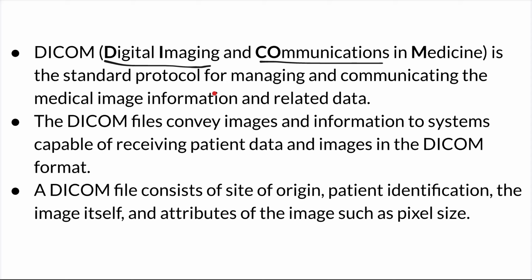I don't know if you've heard of the word IP address, Internet Protocol. If you've heard of TCP, Transmission Control Protocol. You've also heard of HTTPS, Hypertext Transfer Protocol Secure. These are rules that our devices have to follow in order to share files on the internet. The same analogy can be applied in the medical field, where DICOM is what we use so that we can share files and communicate. The standard protocol that governs this communication and sharing of files is DICOM.